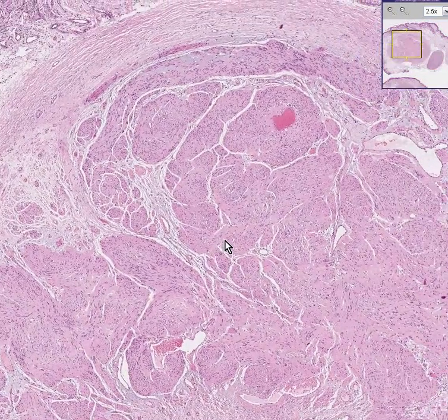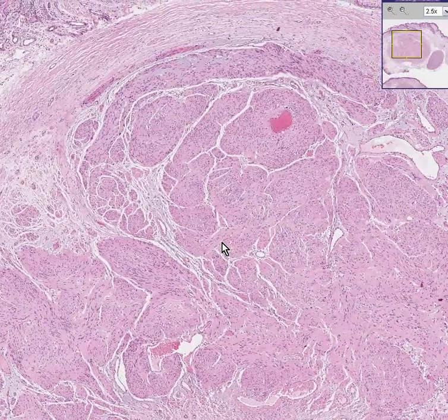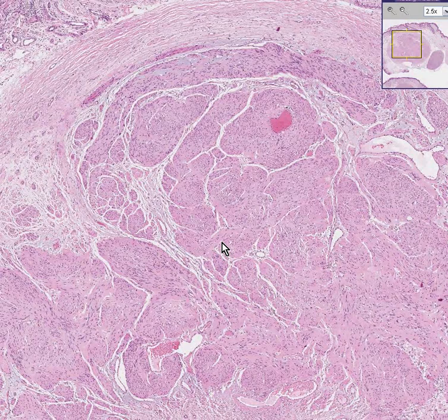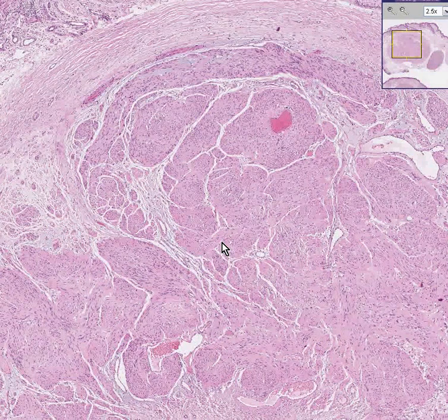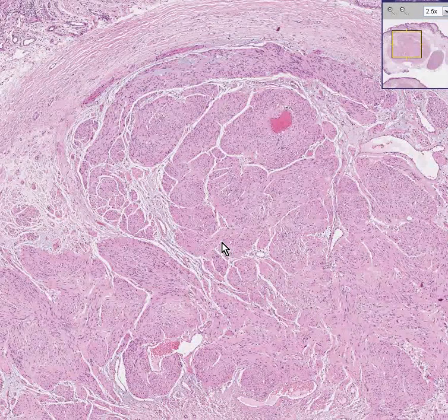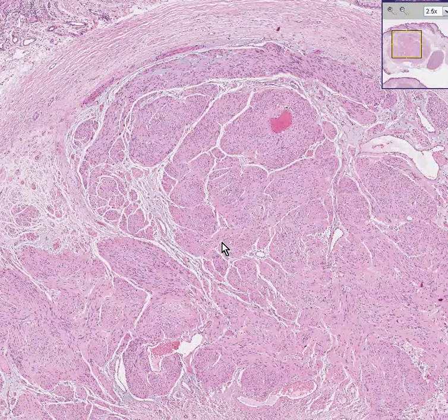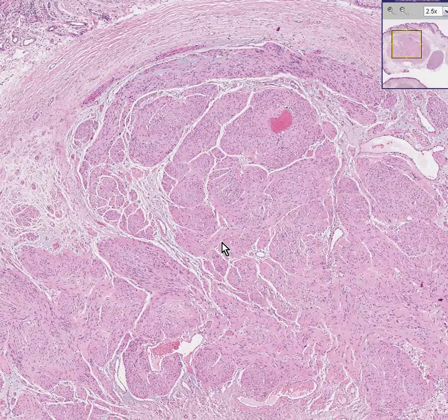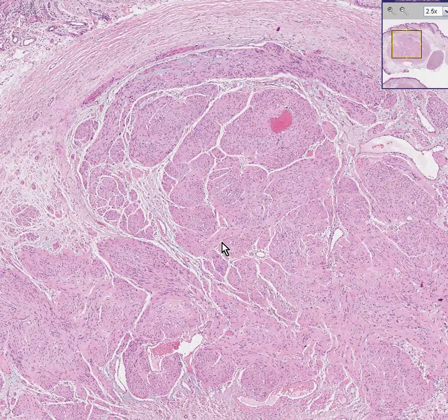This is a Schwannoma. A Schwann cell is the principal cell of a peripheral nerve. It is the cell that makes myelin — the cell that myelinates axons of peripheral nerves. Tumors of these cells are called Schwannomas, although we saw another case when it was just called a neuroma. We also saw another case when it was called granular cell.